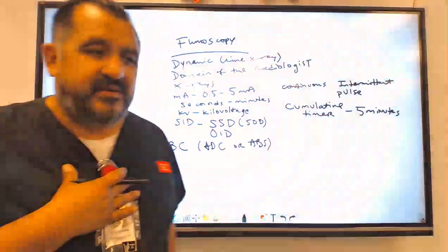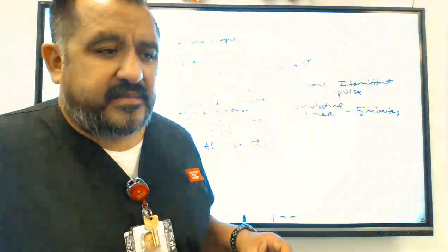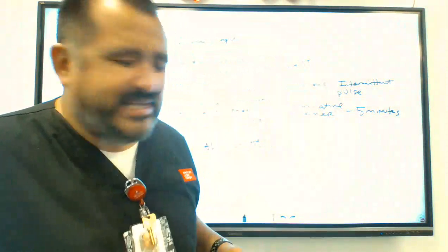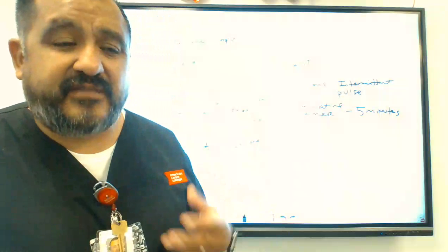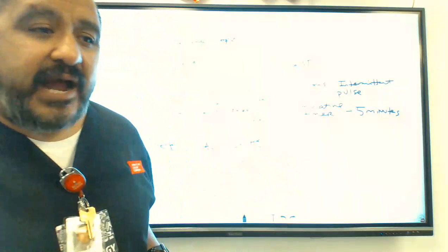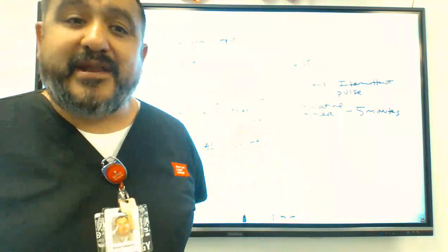I use ABC when I discuss automatic brightness control. I think Mr. Gomez, I heard him say ABC as well. I don't hear too much ADC or ABS, but again, you have to know that there are going to be other terms related to that. So again, I wouldn't mess around with technique. I would go ahead and press automatic.